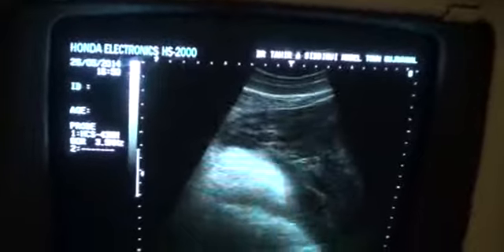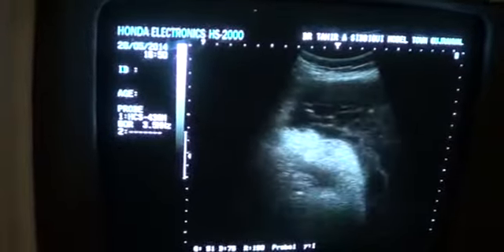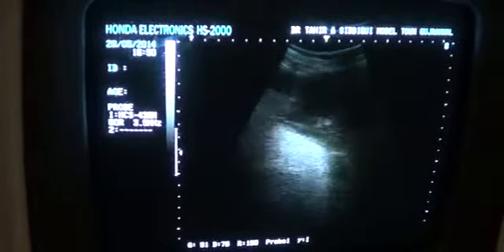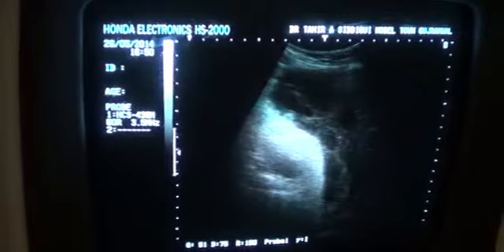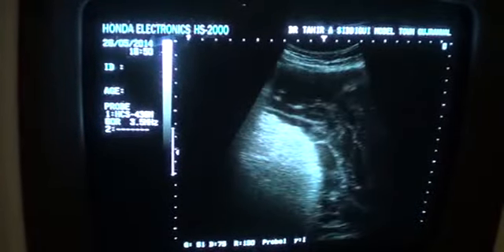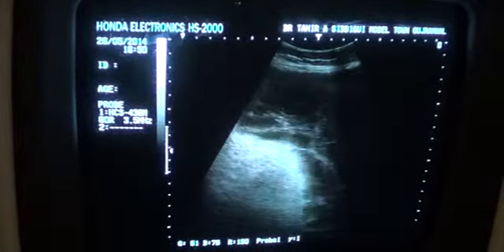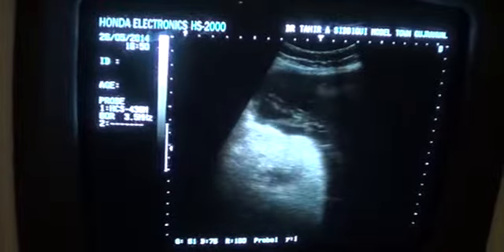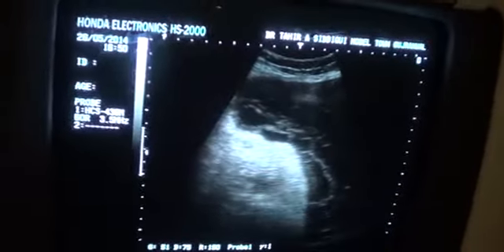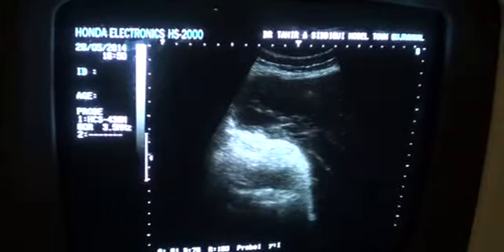I can follow this white band of tissue up to the right lumbar region, and it goes posteromedially, this white band, the retained placenta.